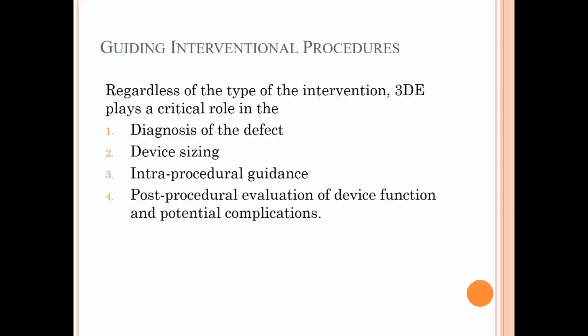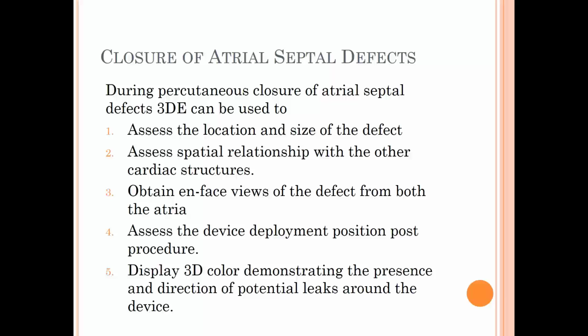You're going to have it, for instance, lying on the mitral valve or on the tricuspid valve or affecting the aortic valve. This is of paramount importance. Also, the post-procedure evaluation of device function and potential complications can be easily evaluated during the percutaneous closure, for instance, of atrial septal defects.